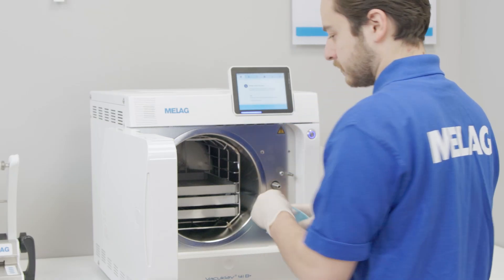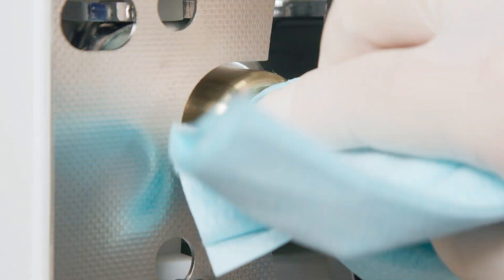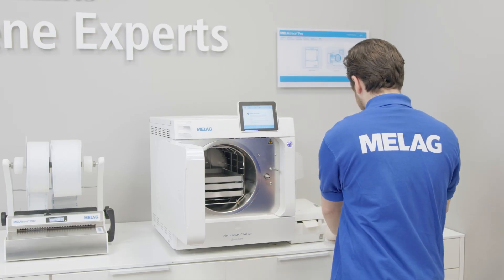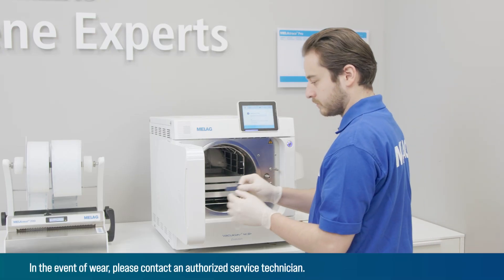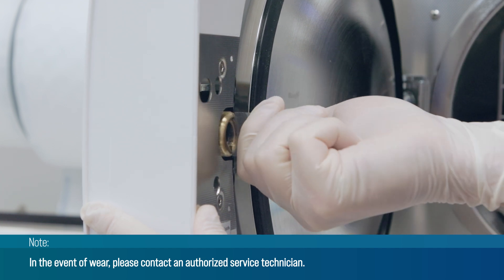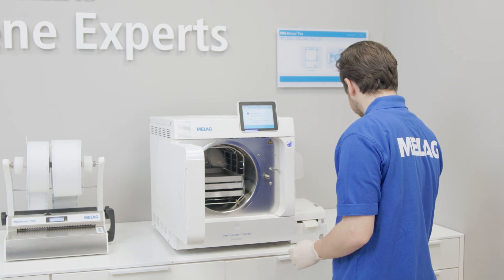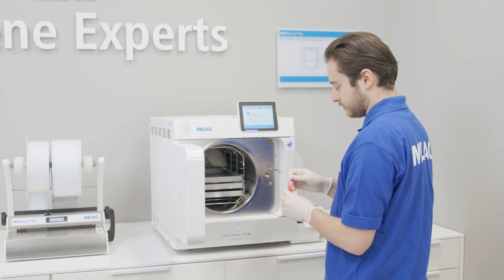Start by cleaning the locking spindle and nut. Please use a non-fuzzing cloth for this. Then insert the check gauge into the lock nut as far as it will go and turn it 180 degrees. If you feel resistance, or if it is not possible to turn, the locking nut is worn.